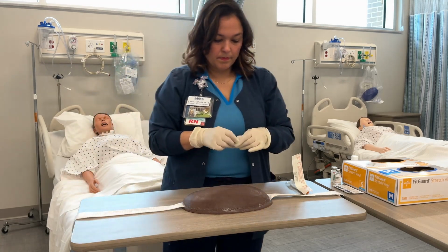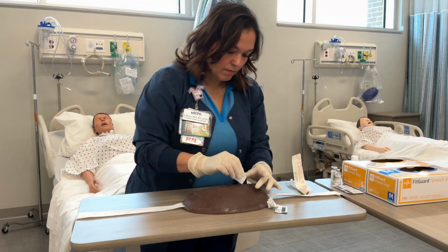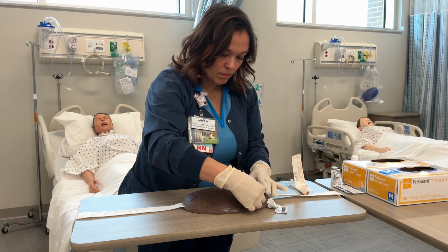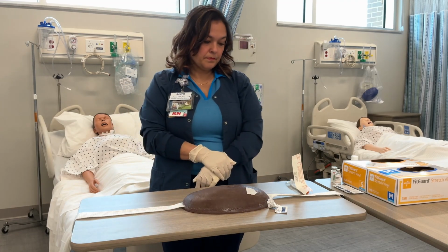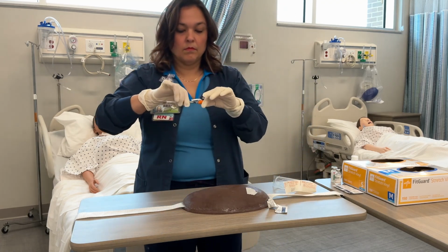Okay, we're going to clean the area that we've selected with alcohol swab by wiping with a circular motion, moving outward from the injection site. We're going to let this dry. We're going to remove the needle cap with the non-dominant hand by pulling it straight off.